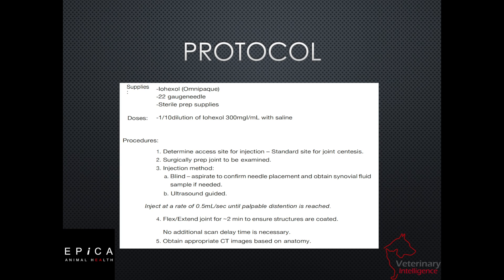We're going to inject into the joint space. Some people use an ultrasound to guide their needle; others do not. Others may turn on the fluoro. Vimago systems have a fluoroscopy mode that you can use to guide your needle into the joint space, and there are some who are good enough to do it blind. We're going to inject at a rate of 0.5 mils per second, waiting for palpable distension.